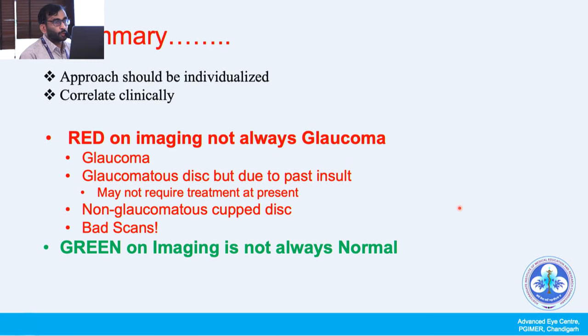To summarize, the approach should be individualized and correlated well clinically. Redness may mean glaucoma, a previous insult of glaucoma, non-glaucomatous cupping, or maybe a bad scan. Green on imaging is not always normal. Keep that in mind. Thank you.